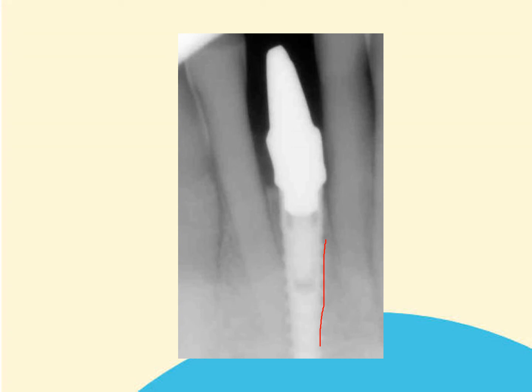The abutment in this situation is very slightly larger than the diameter of the implant. This is because this implant is a 3.25 diameter implant, and the abutment is most likely 3.75, so the abutment will overhang the implant. Now, this type of appearance will be seen on the anchor lock as well, but the main thing to notice is this lead-in. There's a 45 degree taper lead-in. This is only seen on the series 1, series 2 and EasyPlants. You will not see this on the anchor lock. So this is what tells us that this particular implant is a series 2 type of interface.